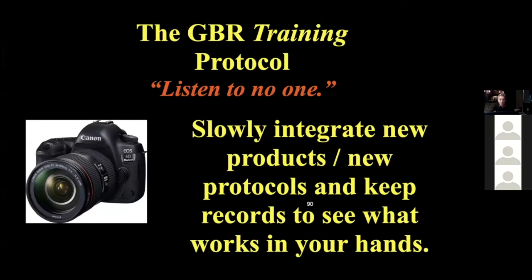So, what about bone grafting? What the heck do you put in the socket? Demineralized, mineralized, collagen plug, nothing. I mean, there are studies for everything you can think of. Here's what I would tell you to do. I swear this is another gem that wasn't listed in the beginning.